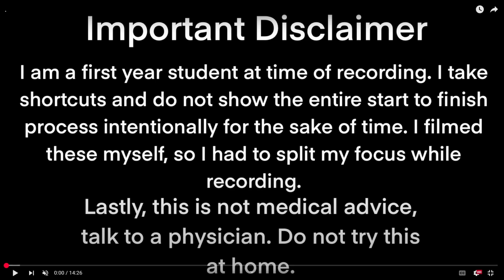Lastly, and likely most importantly, this is not medical advice. Talk to a physician. Do not try any of this at home, obviously. Now the skills I'm going to be showing today are going to be oral airway insertion, nasal airway insertion, LMA and I-gel insertion, intubating with a Mac and Miller blade, video laryngoscopy, spinal anesthesia administration, epidural anesthesia administration, IV catheterization, and central line placement. So let's get into it.